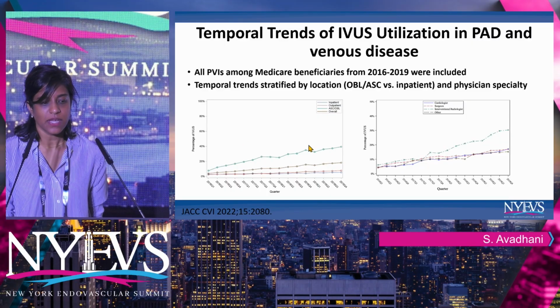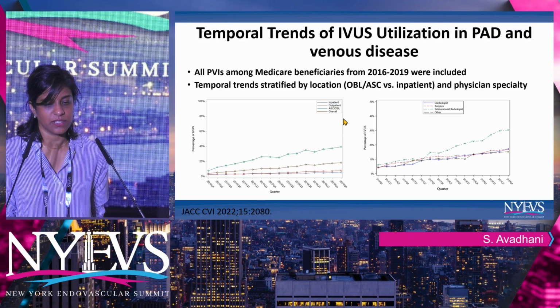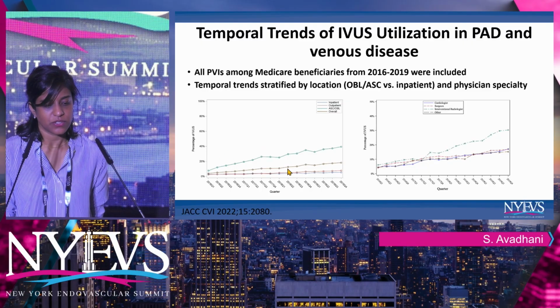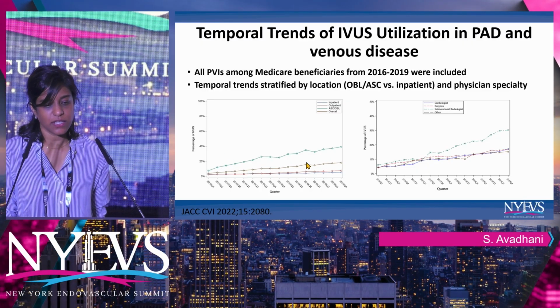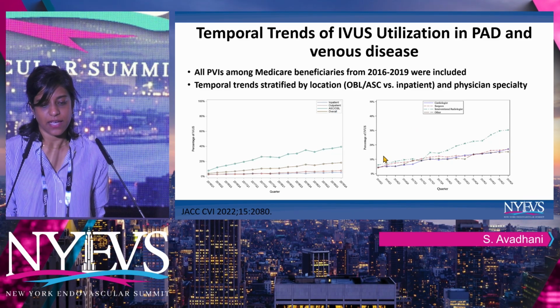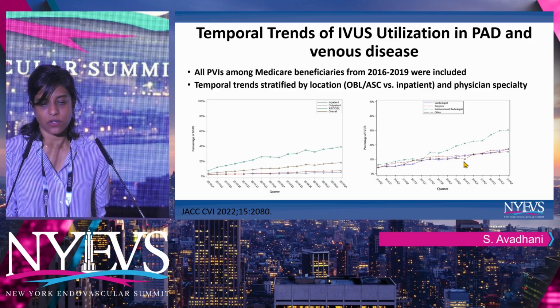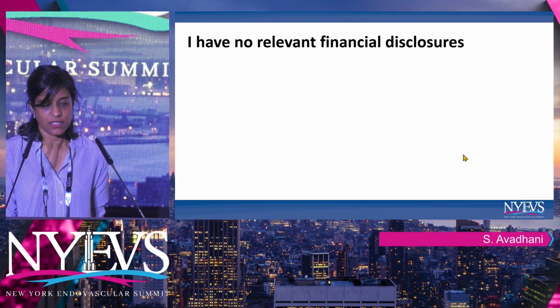This one's from a database of Medicare beneficiaries between 2016 and 2019, with reassuring trends that, in general, the use of IVUS is increasing, more so in the ASC OBL setting, and this stratifies the usage across specialties.